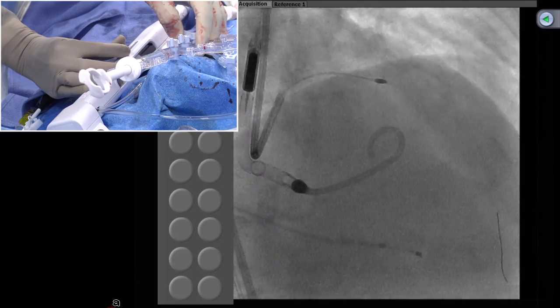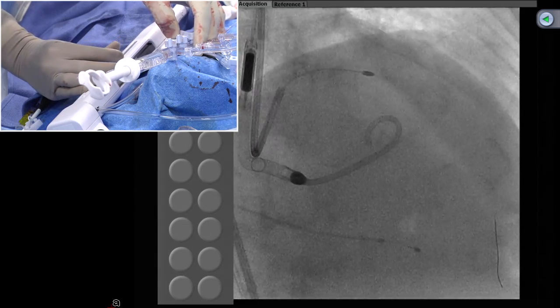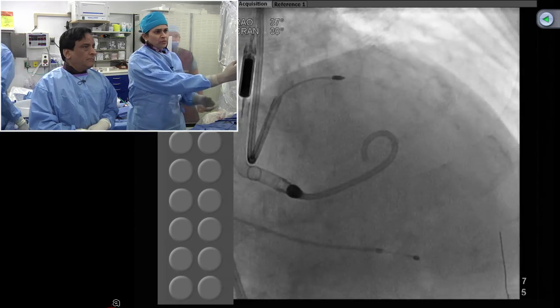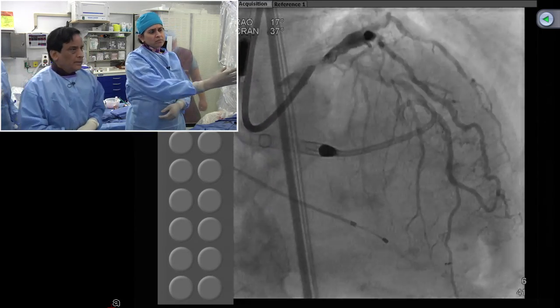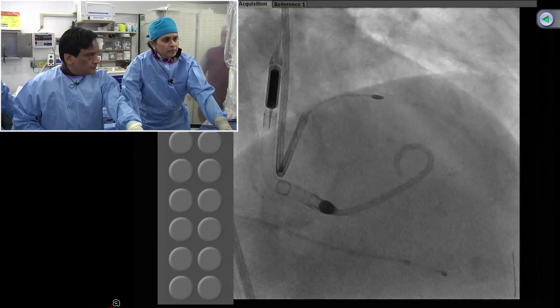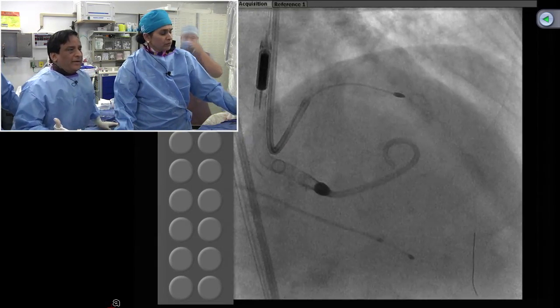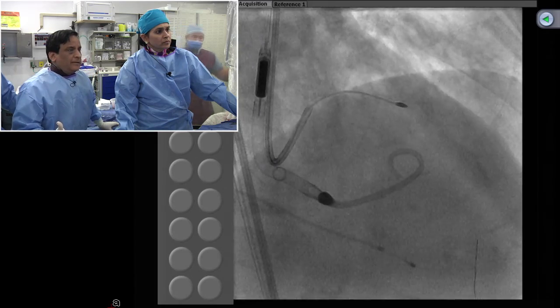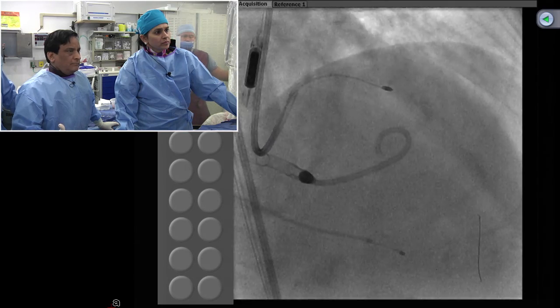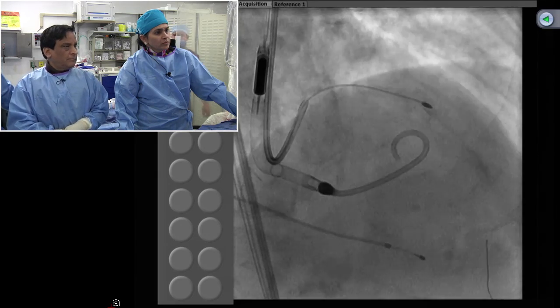That's a very good technique. The understanding is that with increased RPM and if you have very long passages, heat develops inside the artery, and that we think is the genesis of spasm and no-flow or slow-flow. The shorter the runs, the more slow and pondered the approach, the less no-reflow you will get. You can see that 1.5 is giving us so much difficulty in the mid-segment. Just be patient with it and don't downsize unless you have to.